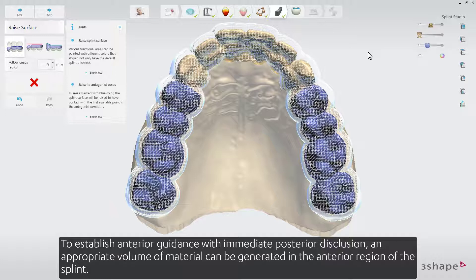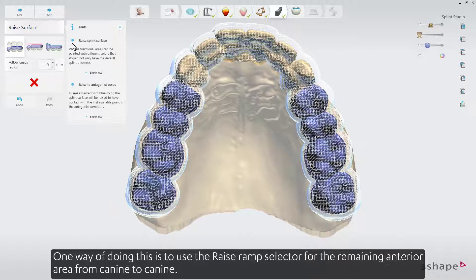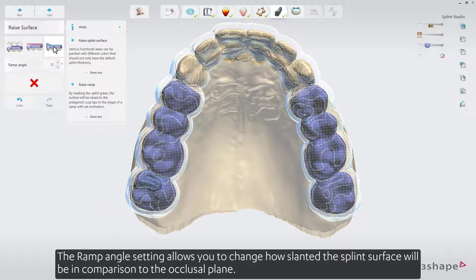To establish anterior guidance with immediate posterior disclusion, an appropriate volume of material can be generated in the anterior region of the splint. One way of doing this is to use the raise ramp selector for the remaining anterior area, from canine to canine. The ramp angle setting allows you to change how slanted the splint surface will be.